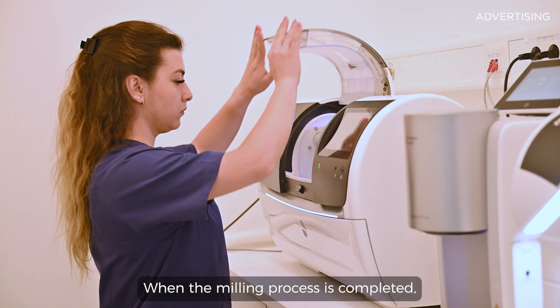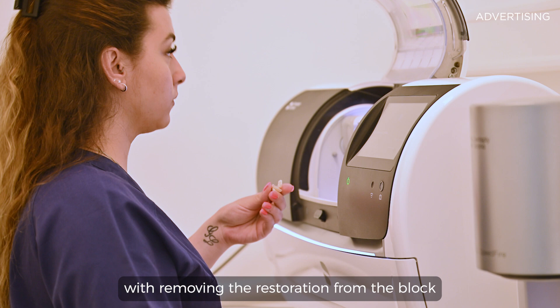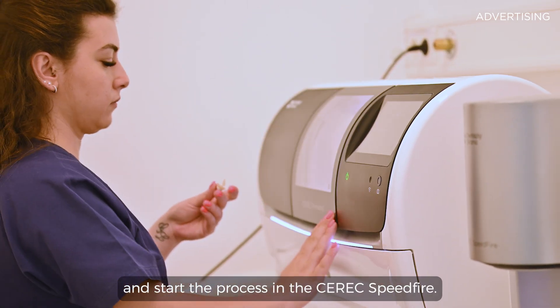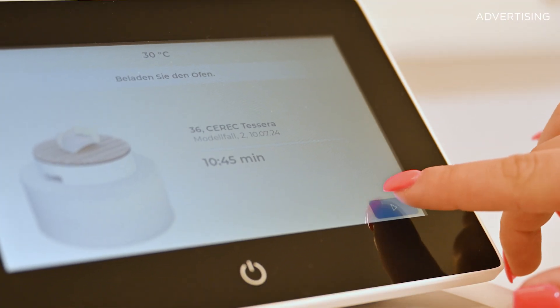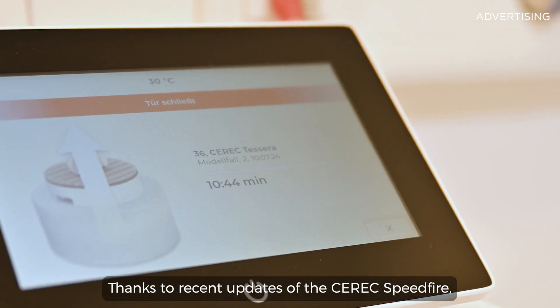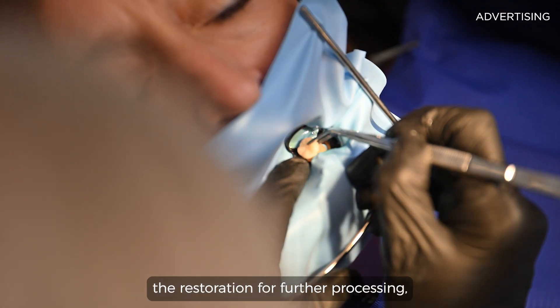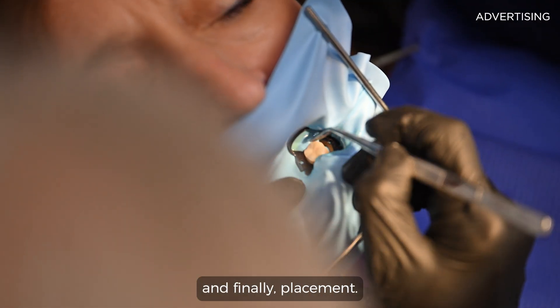When the milling process is completed, we continue with removing the restoration from the block and start the process in the CEREC speedfire. Thanks to recent updates of the CEREC speedfire, my assistant can see when it is safe to move the restoration for further processing and finally placement.